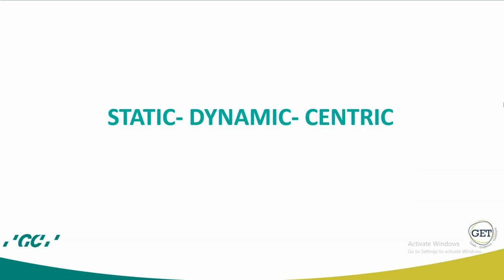Defining static, dynamic, and centric relation. Finding the centric relation might sometimes seem hard, but with appropriate devices such as deprogrammers, for example the Kois deprogrammer, it'll become just obvious.